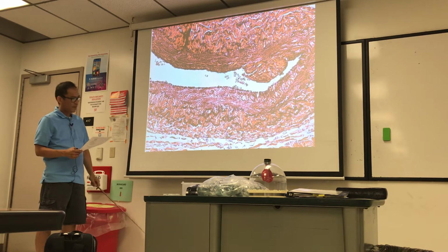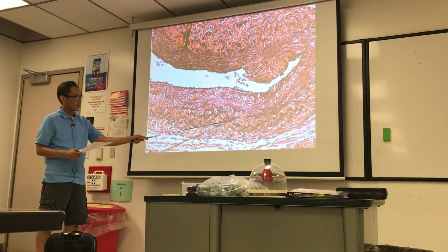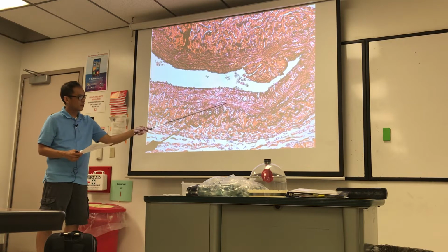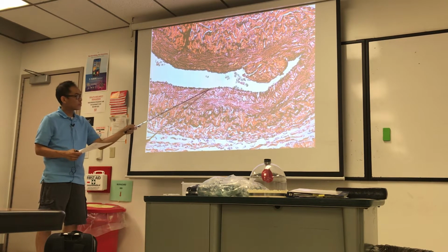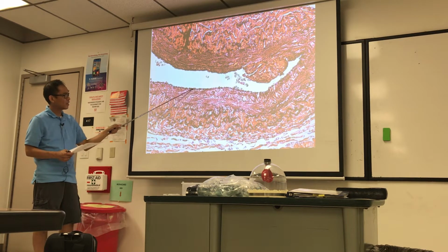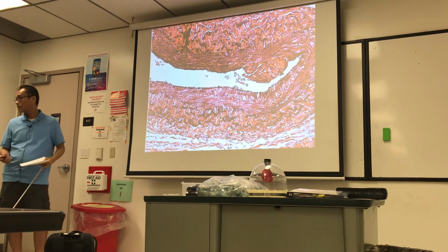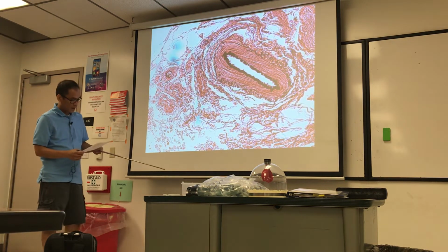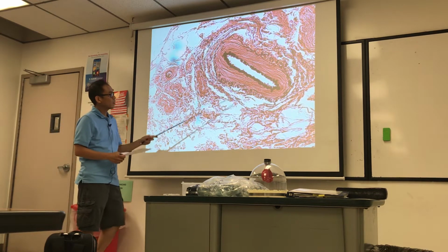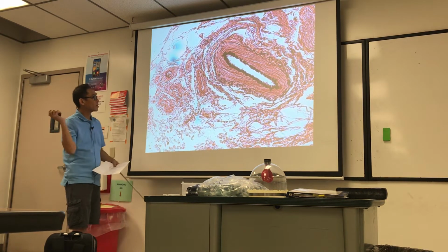Okay, and it's the same tissue types. You have collagen fibers, the red, the black is elastin fibers, and the same for here. The pinkish is smooth muscle, and the black is elastic fibers. You can even see a little bit of elastic lamina in the TI here, the black tissue there. Here's another example of a muscular artery, TI, TM, TA, okay, same as before, just another one.